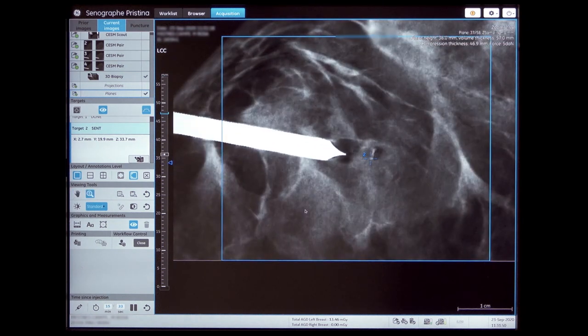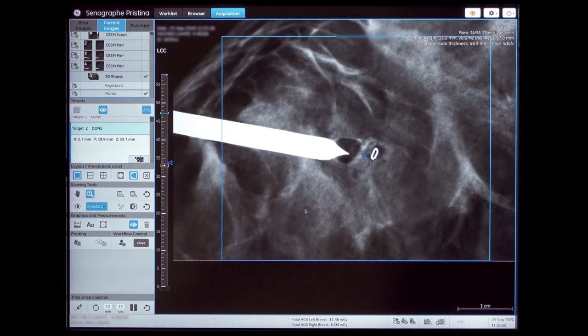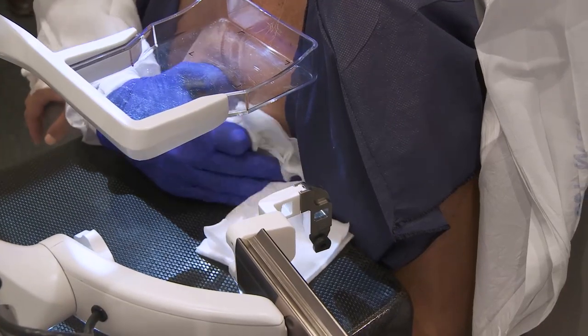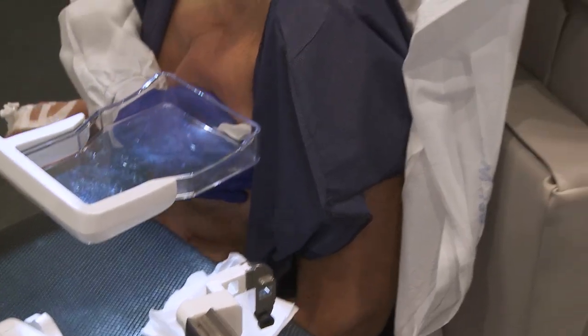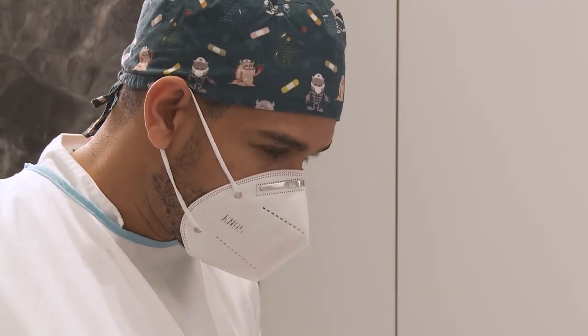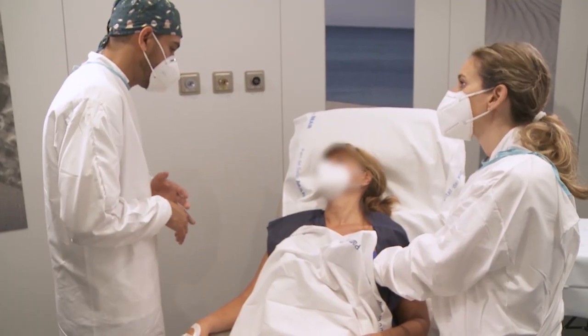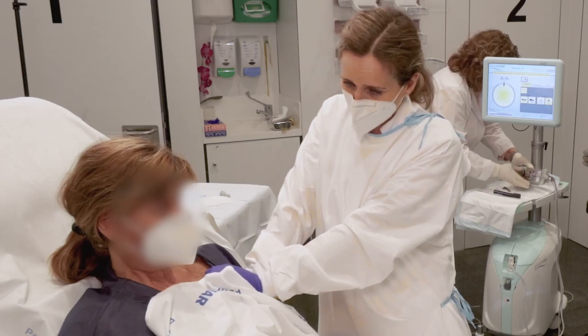Scroll through the planes to check the tissue marker placement versus the biopsy coordinates. The exam is finished. The breast is decompressed. Information about how to proceed after the biopsy is given to the patient while tight compression is applied in the biopsy area for hemostasis.